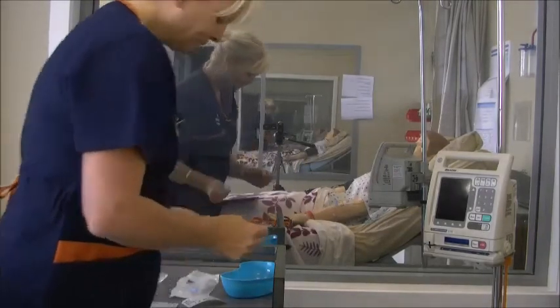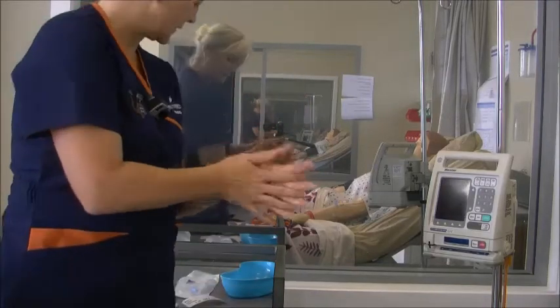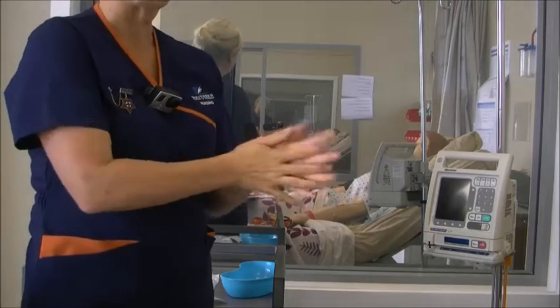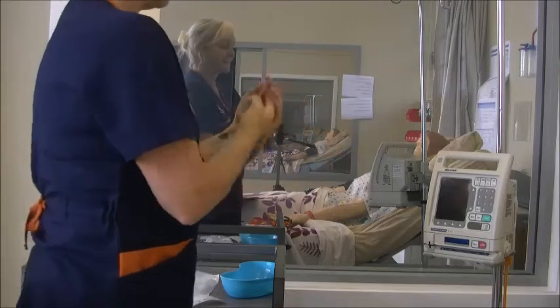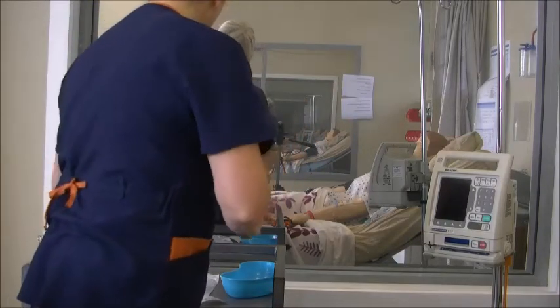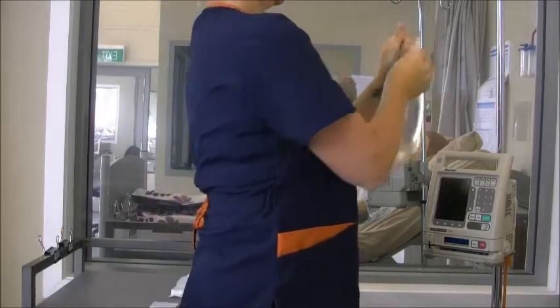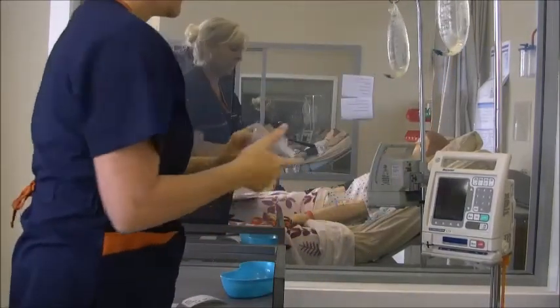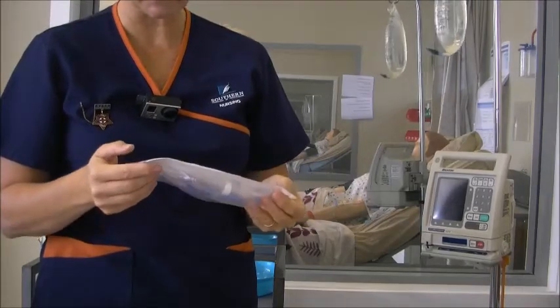Alright, so I'm just going to give my hands a quick wash again because I've been touching that packaging, and I just want to make sure that they're nice and clean before I start. So I'm going to hang it up on the IV pole here. I'm going to open up my tubing. Now these have like a serration.